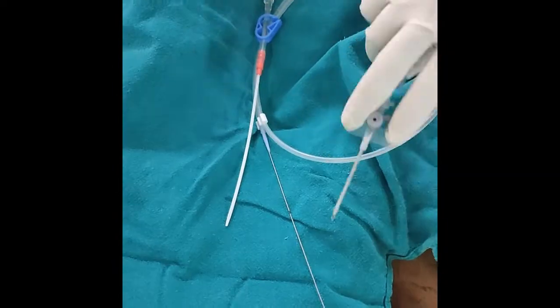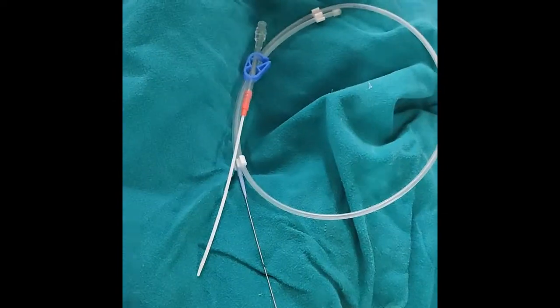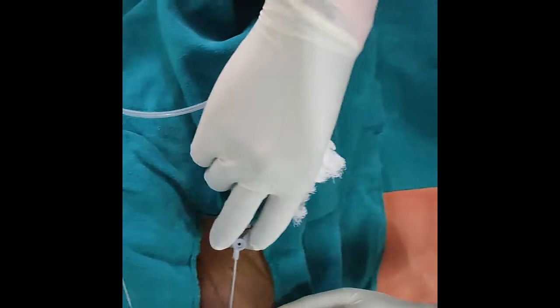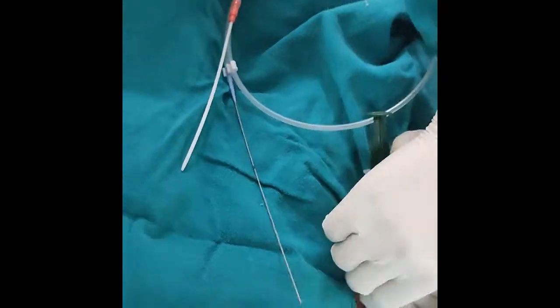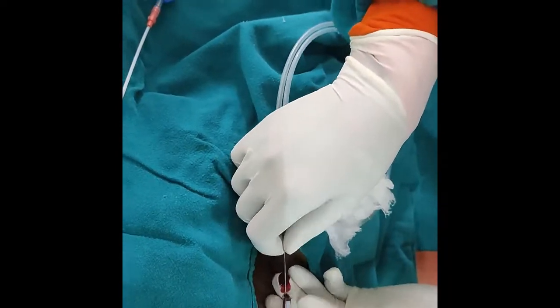Now I am going to insert this cannula just medial to where we felt the pulse — one centimeter medially and one centimeter below — using the Seldinger technique. Now I am inserting the guide wire through this cannula.